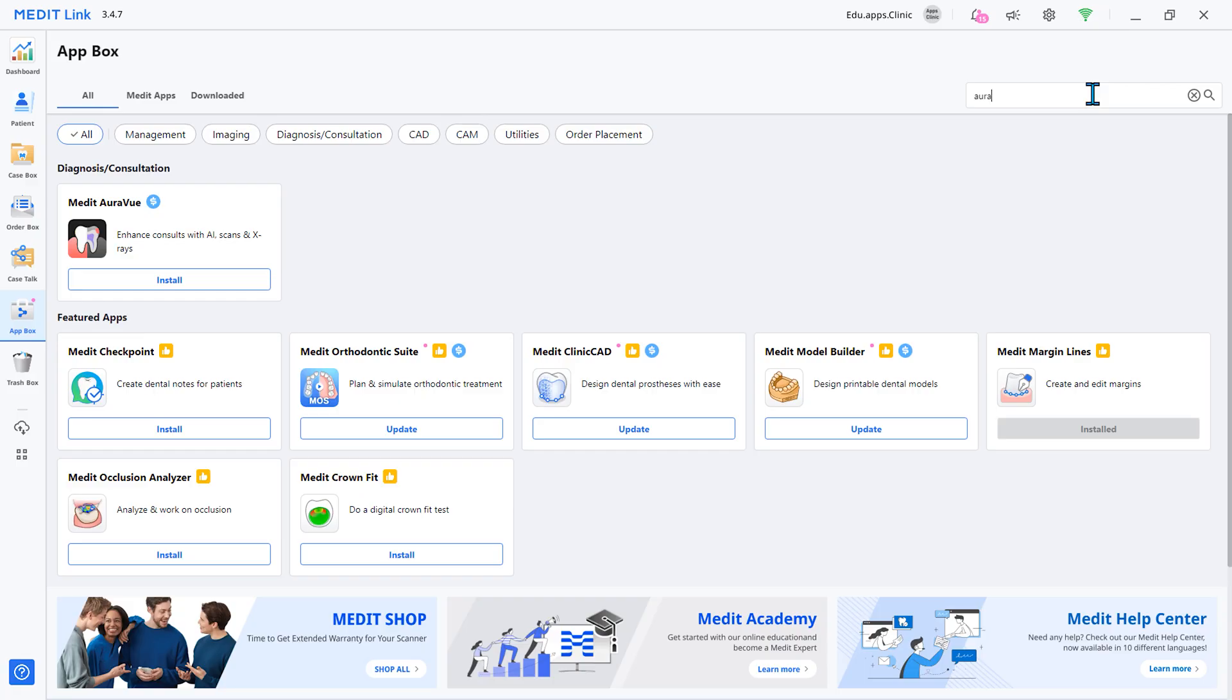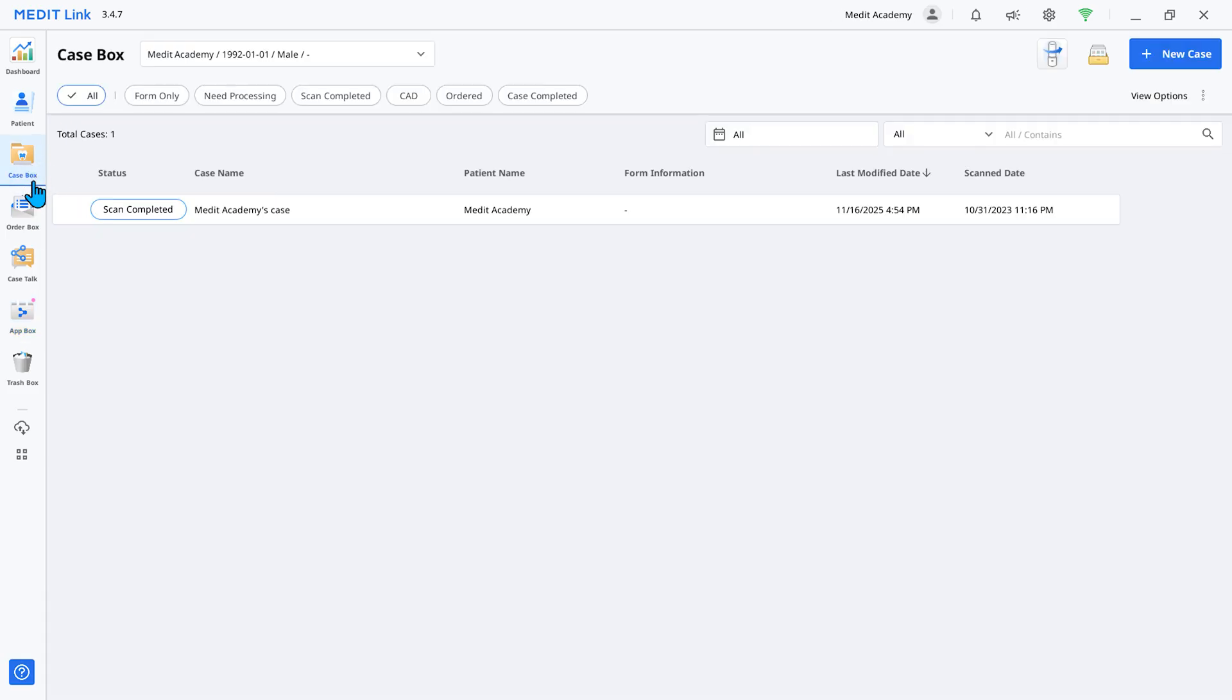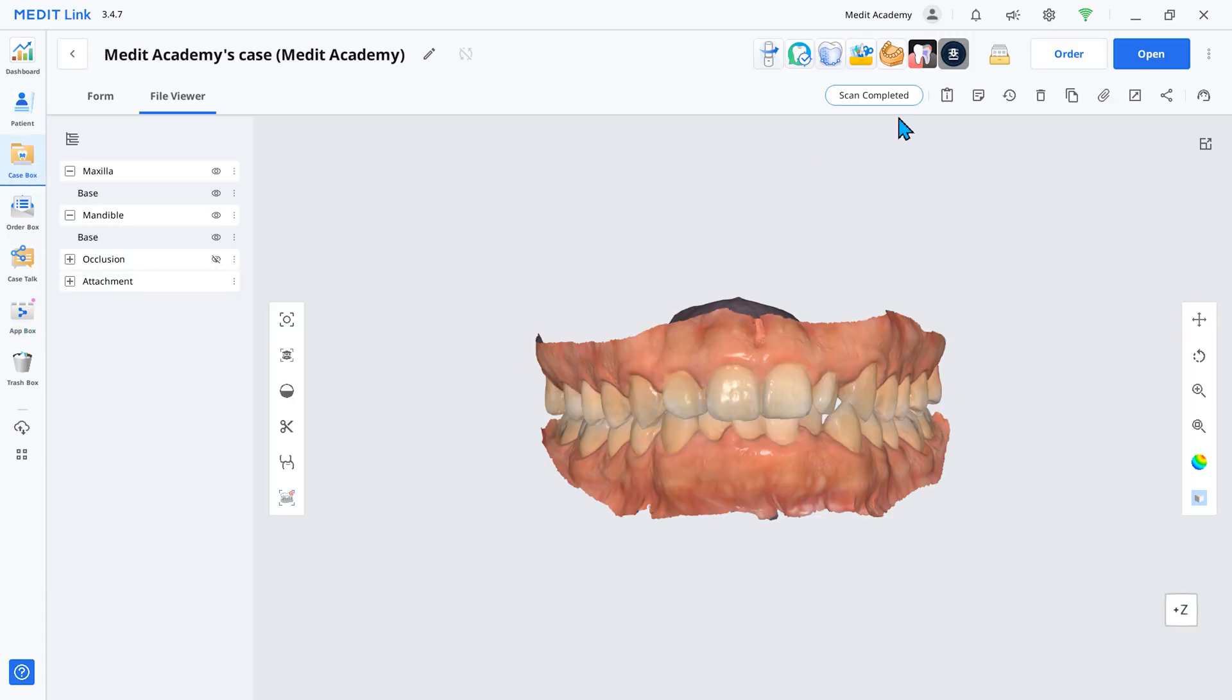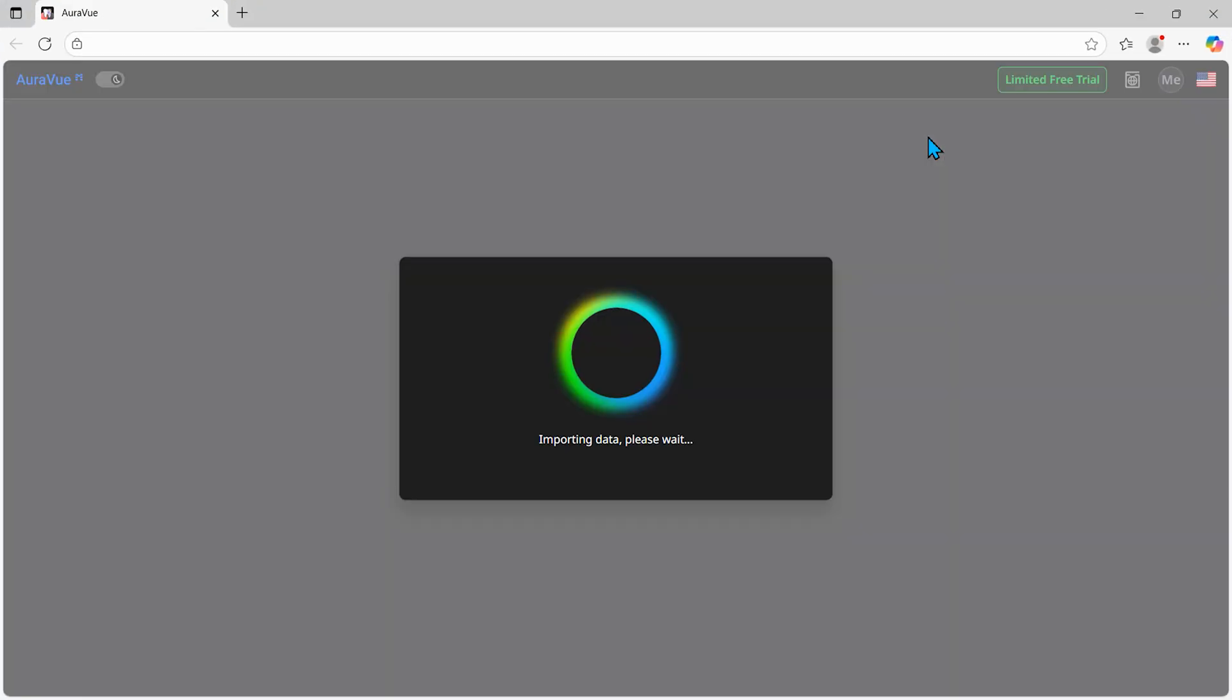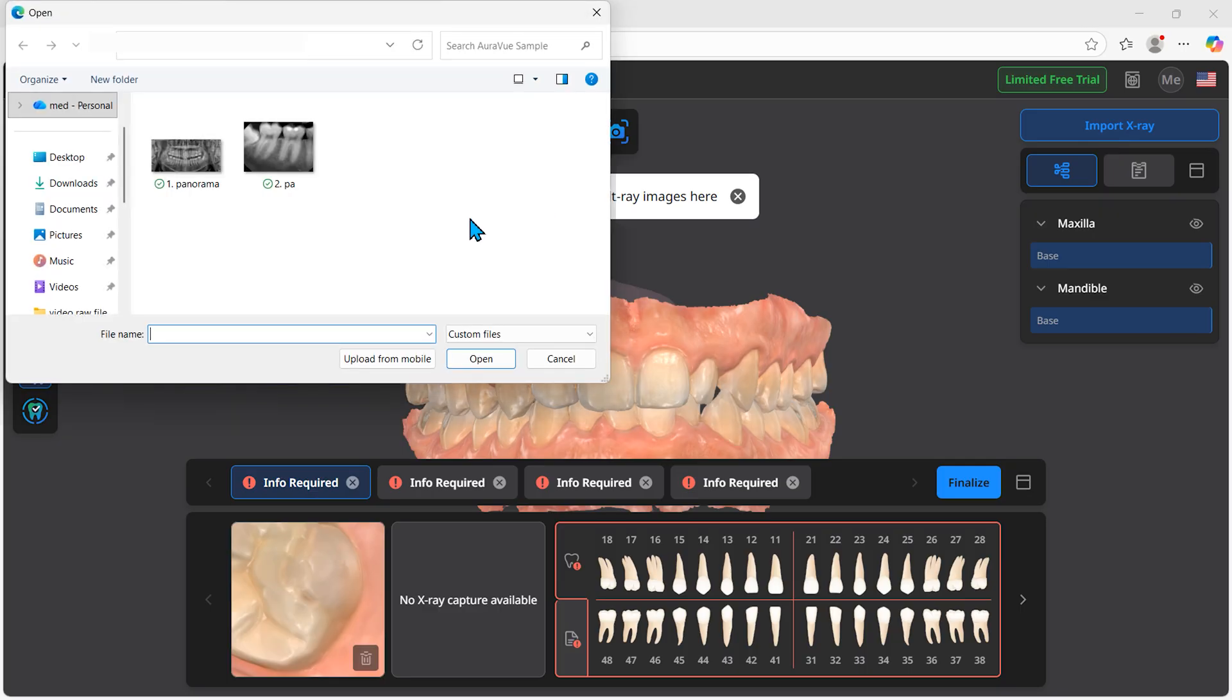First, download Medit AuraVue from AppBox. Open the patient's scan data for which you want to create a report, then launch the app. Now, upload the patient's radiograph images.